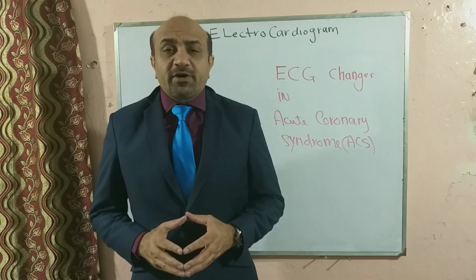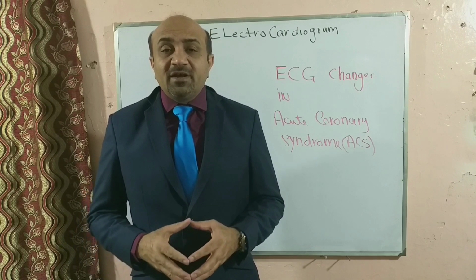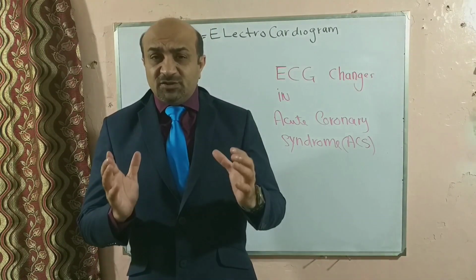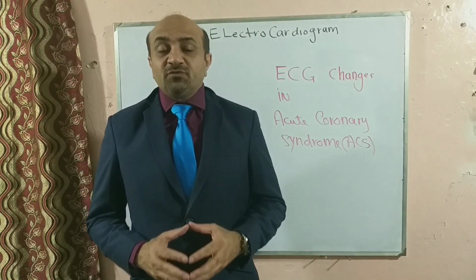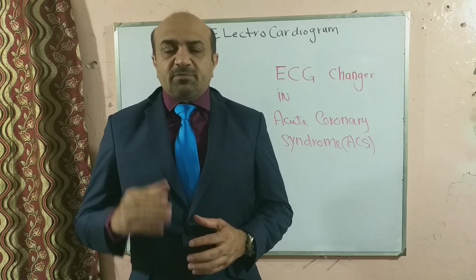Again, this is a very important topic because so many patients come in the emergency department and critical care unit with certain signs and symptoms, and they have got ECG findings, which we shouldn't miss, because if we miss the changes, we can miss the patient. So try to understand the concept of it.